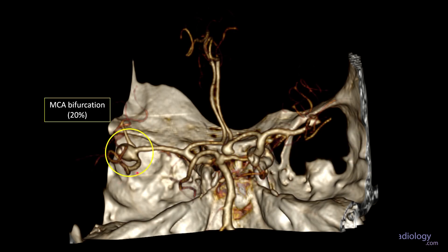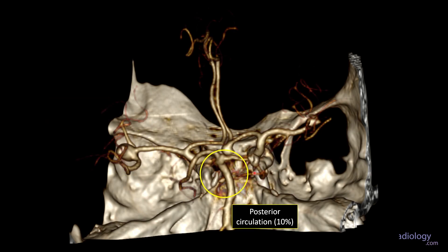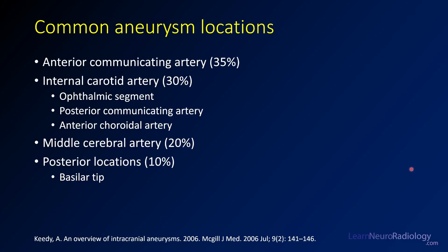The third most common location is the MCA bifurcation, making up about 20% — you can see this person has a second aneurysm here at the MCA bifurcation. The final location is the posterior circulation: basilar tip, proximal PCAs, a little further around the PCAs, and SCA origin, making up only around 10%. So about 80 to 90% of aneurysms are in the anterior circulation, with only about 10% in posterior locations, the most common being a basilar tip aneurysm.